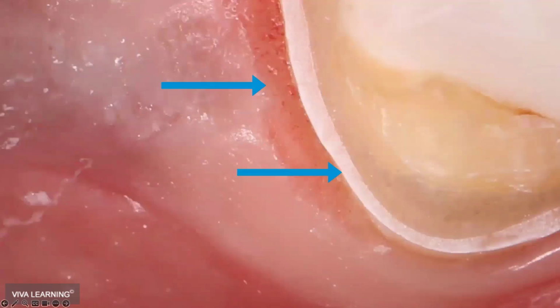All right, quick question back to the zirconia crown. It says basically, it doesn't absorb the energy, so how does it cut? What we feel is happening is like if you threw a baseball at a window and it didn't blow the window out, just fractured it like a spider web. That's what it does to zirconia. We think it's because the traditional properties of zirconia are that it doesn't absorb or disperse energy very well. So I think we're almost overloading the system and then it just cracks.